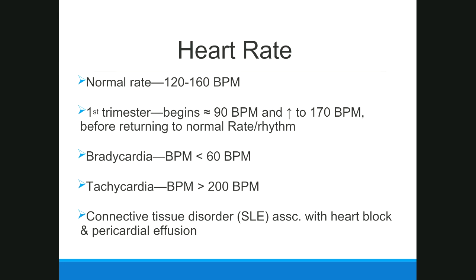It's not abnormal for a fetus to have a really quick pause or just a single abnormal beat. I mean, you get that feeling where you feel like your heart skips a beat every now and then. That happens to me all the time. It's not totally abnormal, but it is important to document because it could be a sign of something like a connective tissue disorder. Pericardial effusions are also commonly seen with some of the connective tissue disorders.